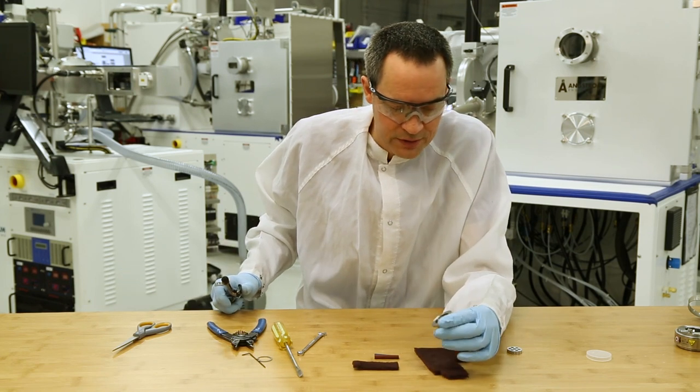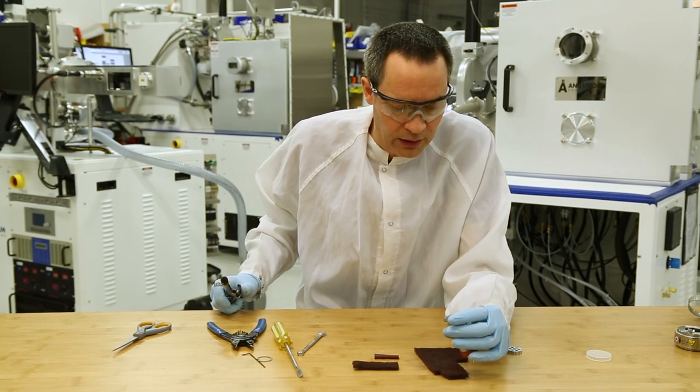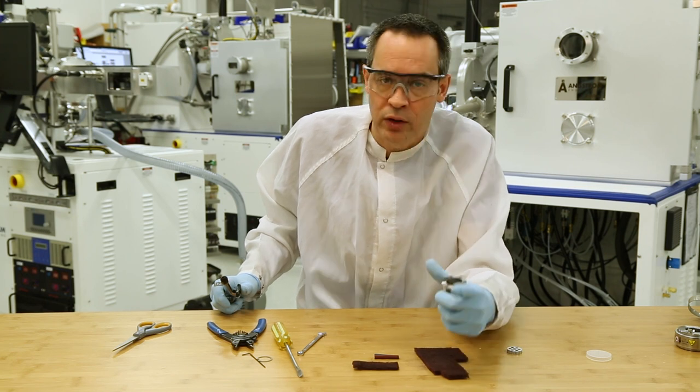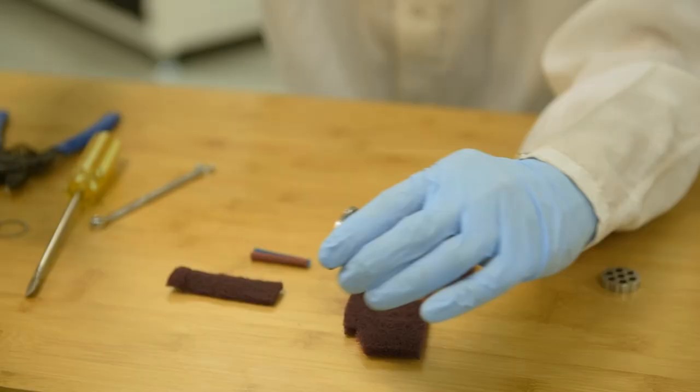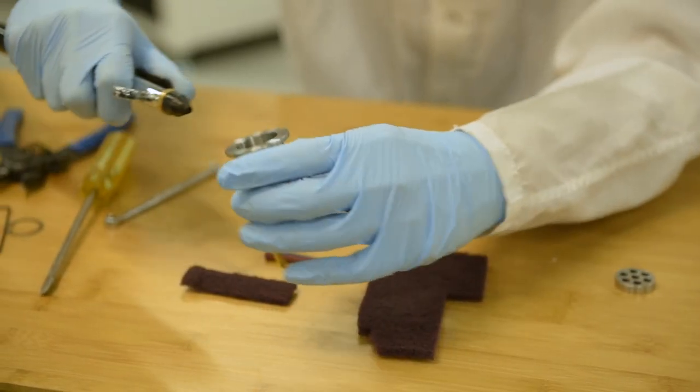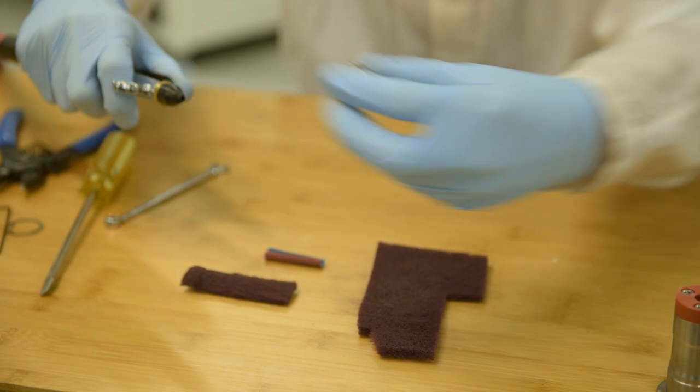Next we're going to blow off some of the particulate. You can use a handheld can of air like you would to clean a computer keyboard. We have compressed air so I'm going to do that. Same for the pole piece.